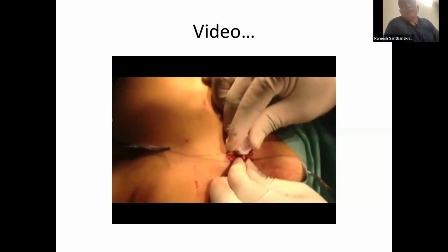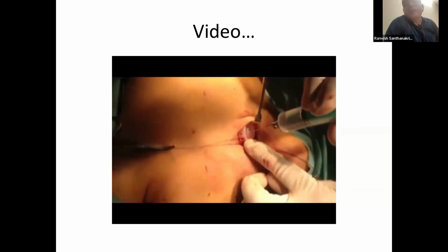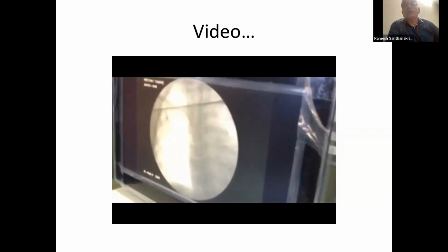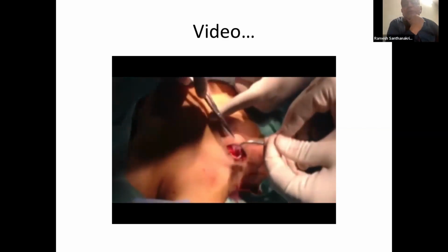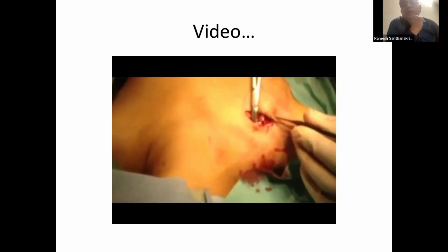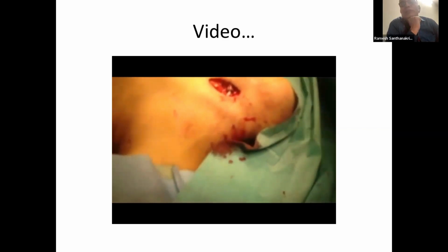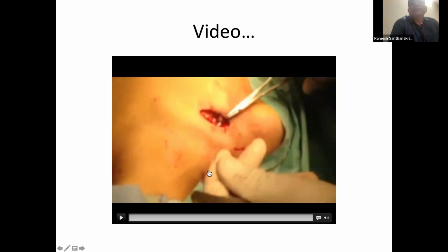The moment it is done, with the pre-placed sutures, we make sure that it is adequately placed inside the pouch. If you can make out, we make sure there is a good amount of skin, a thick skin, over the port, so that the complications are much less. Again, before we finish, we make sure that the port is in position and it is functioning, and we simply close. And we make sure that we start IV fluids. Most of us have a tendency to start using the port right on the table and send the child to the ward with a port which is functioning, to make sure the catheter is adequately flushed and there is no possibility of a clot. Next slide, please.